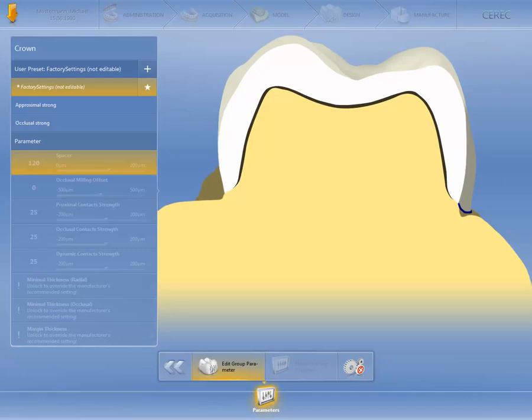The initial suggestion of a crown restoration is calculated based on the parameters specified here. The parameters of the factory settings cannot be changed.